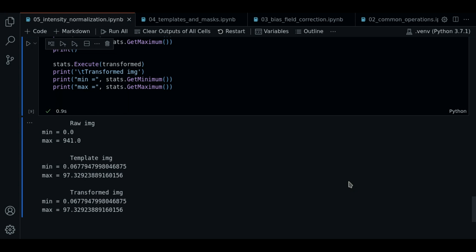So now you know what is intensity normalization and how to do it with histogram matching in sitk. This is the only intensity normalization method we will use. From my experience, this works okay as a default normalization, although other methods could work better for a specific type of study.